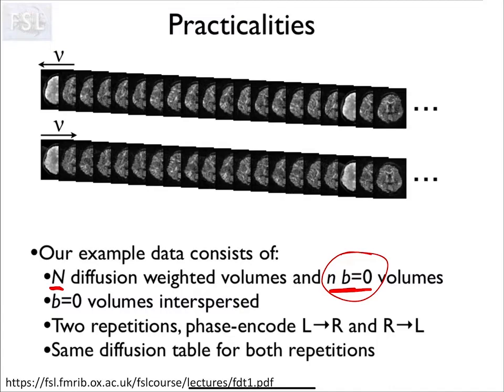And there's really two approaches that are done in the field now. The HCP takes the approach where it will acquire one scan with the phase encode in one direction and another scan with the phase encode in the other direction. So it will acquire two totally different distorted sets of scans. And then it'll merge those two and use all that information to come up with the best sort of estimate. The ABCD takes a different approach because it's really starved for time, where it'll do some scouting scans at the beginning and then use that to correct the rest. So it won't acquire a whole data set in different directions.